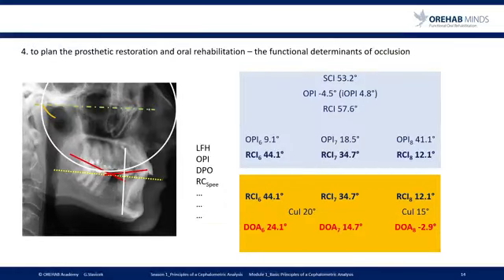Finally, to plan the prosthetic restoration, to plan the oral rehabilitation, the Ceph is a wonderful tool.